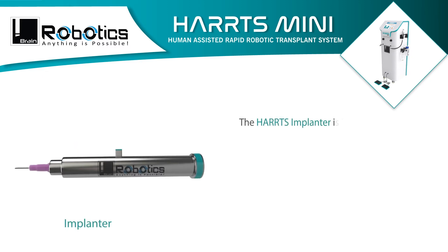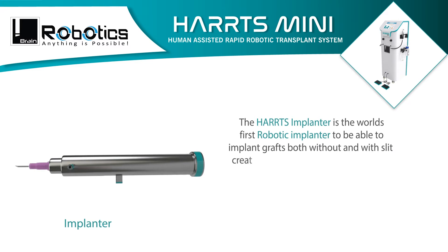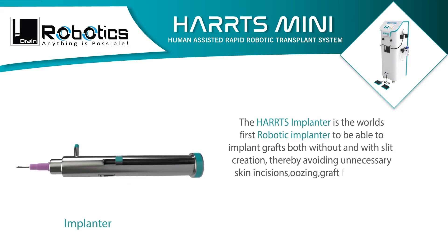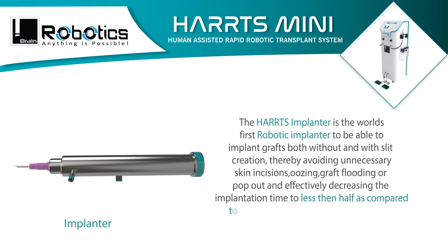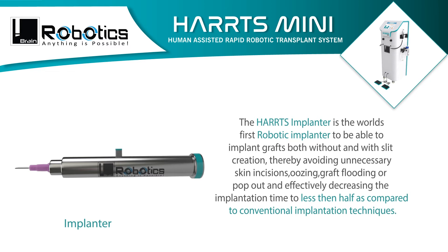The HARRTS implanter is the world's first robotic implanter able to implant grafts both without and with slit creation, thereby avoiding unnecessary skin incisions, oozing, graft flooding, or pop-out, and effectively decreasing implantation time to less than half compared to conventional implantation techniques.